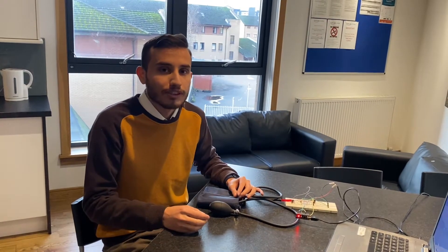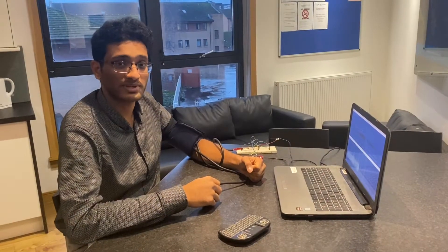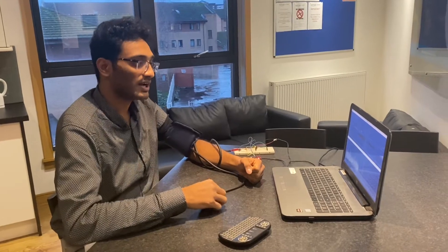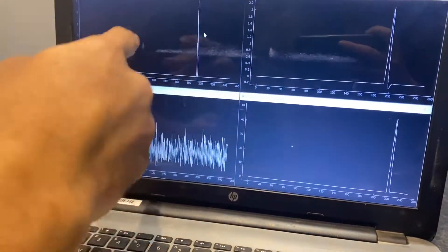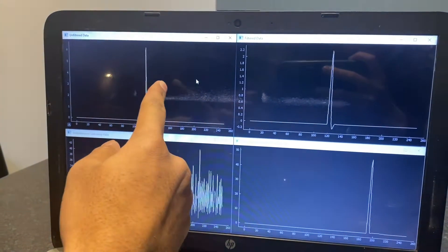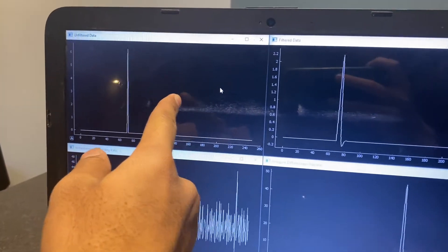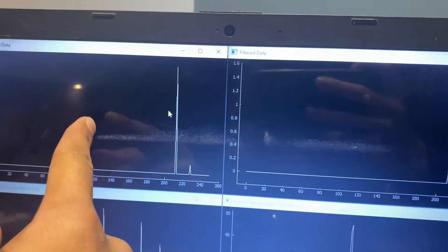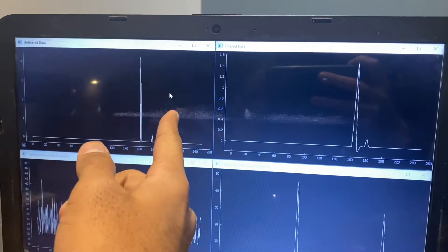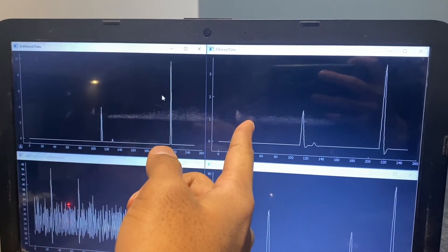Using IIR filtering, as my colleague Raj will explain, we can calculate and estimate the systolic and diastolic pressure. The software displays four windows: one showing unfiltered raw data and another showing the filtered data, which has been passed through a second-order IIR filter that smoothens the signal.